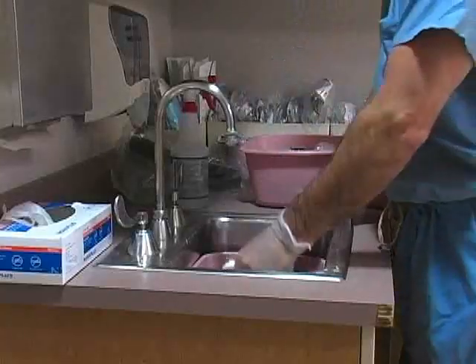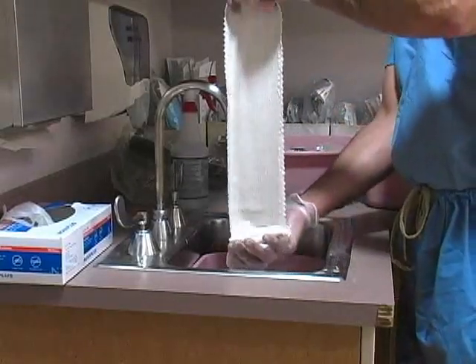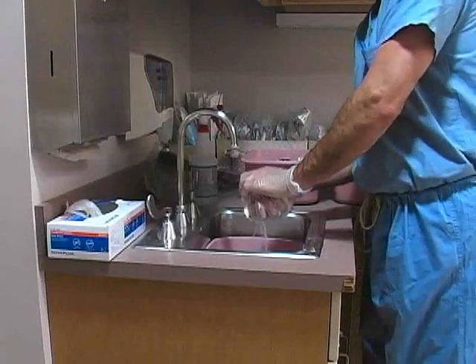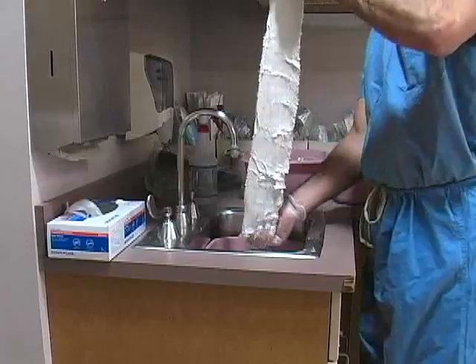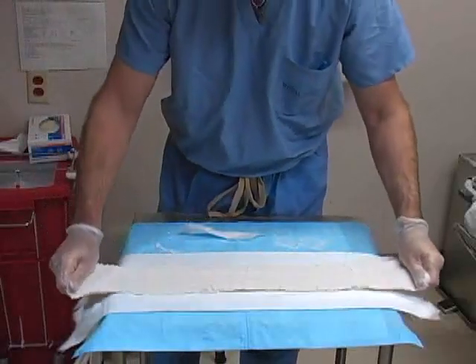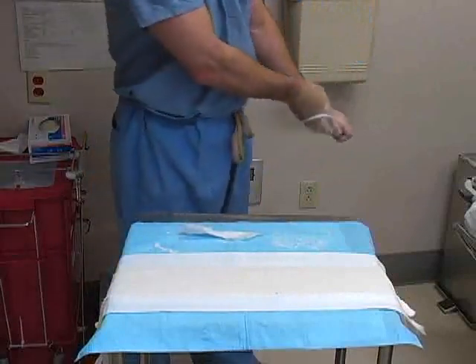Soak the plaster in room temperature water until fully saturated. Raise the plaster from the bucket and remove the excess water by allowing the layers to gently fold down on themselves.